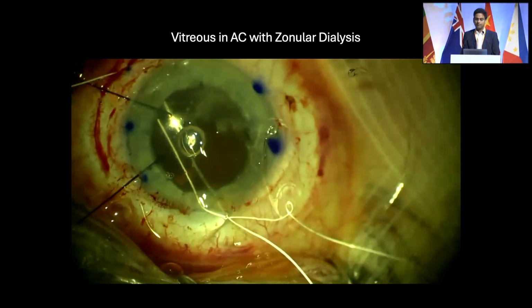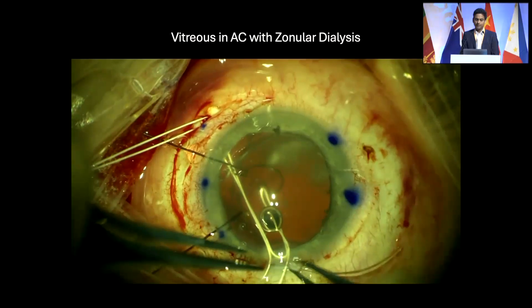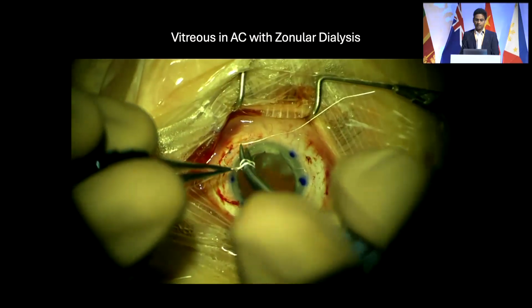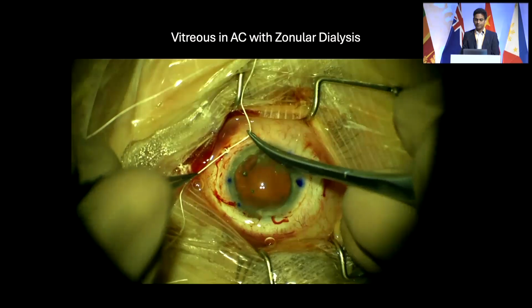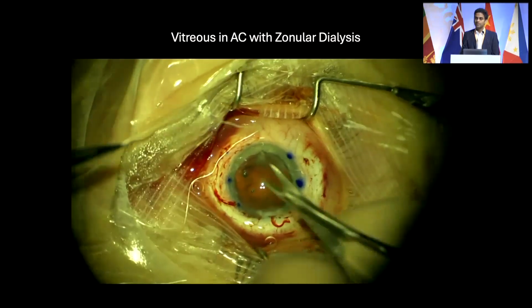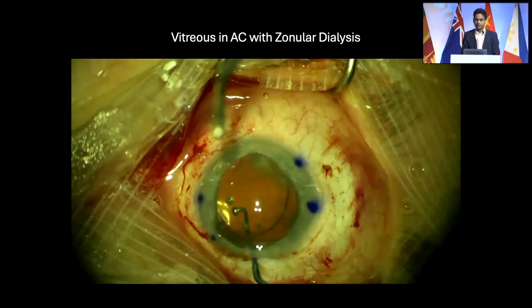So what I do is I take out the needle 2 millimeters from the limbus, 4 millimeters apart. And then slowly slide the single Cioni ring in here. And then when you pull the sutures up, the Cioni ring slides to the area of the zonular dialysis. And you can either do a sliding slip knot or a 3-1-1, but always make sure to bury the knots of the Gore-Tex in, because you don't want to leave it out and get scleral necrosis and conjunctival erosion there.